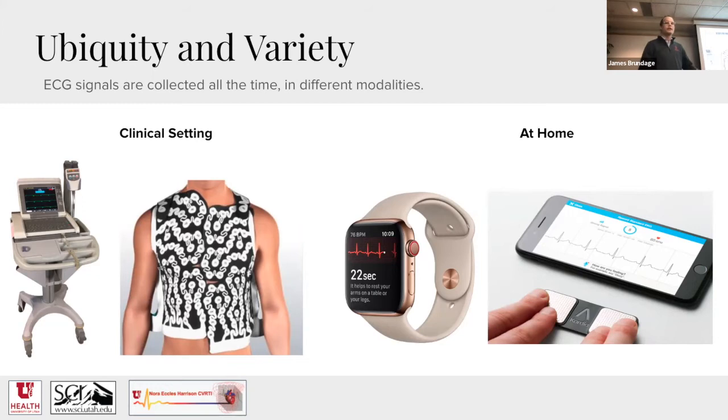Right. There's definitely variability, and I won't claim to be the expert in how good the Apple Watch is at making recordings. But with that said, companies like AliveCore and others use remote monitoring systems, sometimes in the clinical setting, when it's like, hey, we have a patient, we think they have an electrical system problem. We need to send them home, but we want to monitor this activity. So there's certainly a place in clinic for lower dimensional recordings that we're still collecting and still have clinical use.